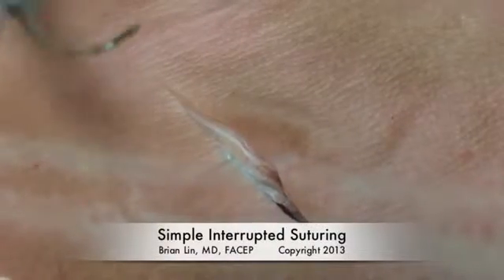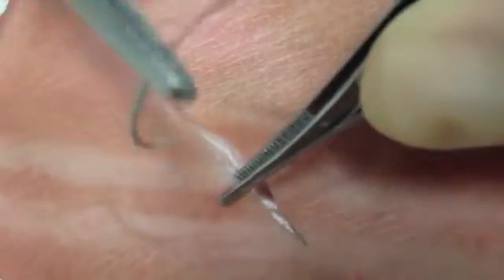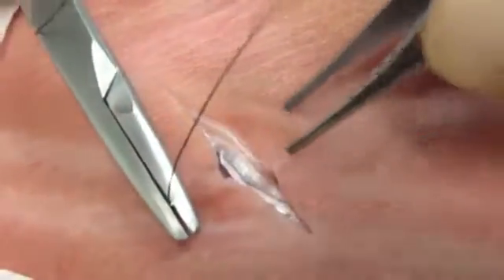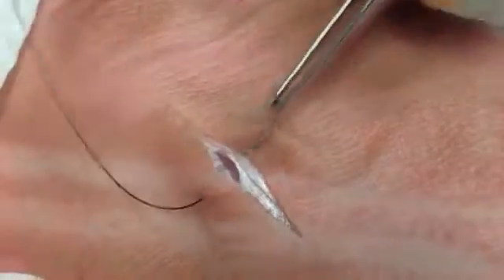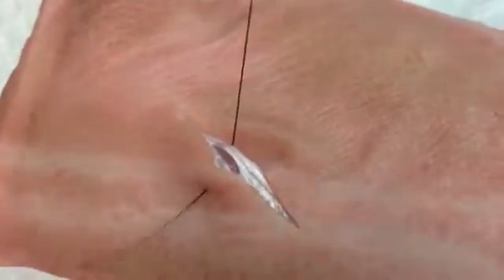This video is a demonstration of the simple interrupted suturing technique. We're using a pigskin model to represent human skin. I'm using a 3/0 nylon suture in this demonstration. Essentially what we're going to do first is traverse the wound, everting the wound edge with a pair of pickups.